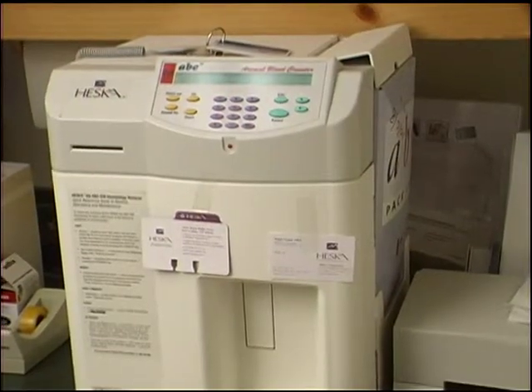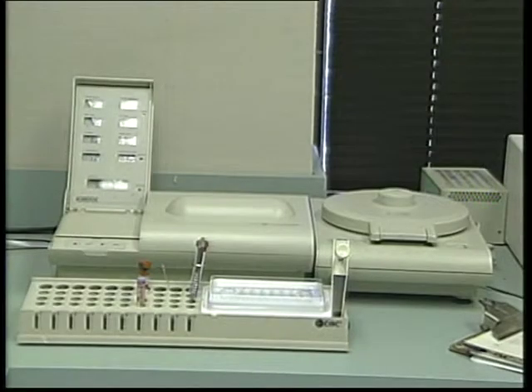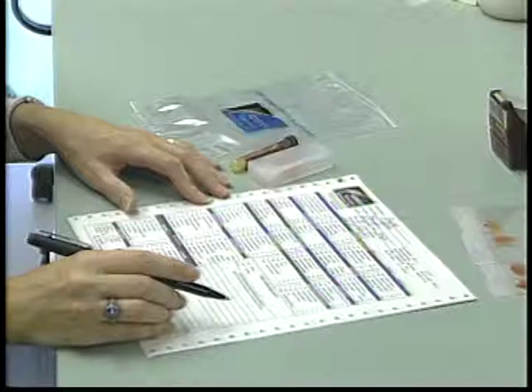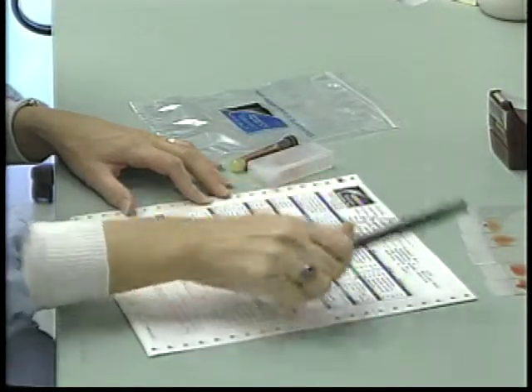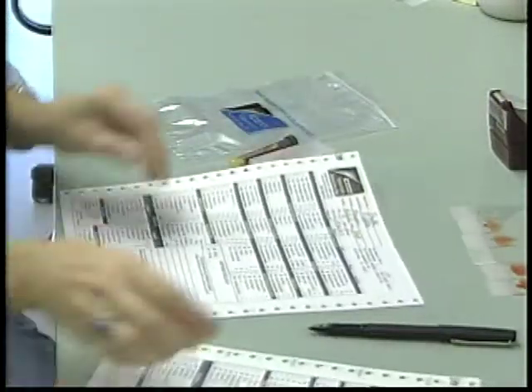Operating these units is relatively easy to learn, and they provide fairly accurate counts or estimations as to the number of blood cells present within the animal. Commercial veterinary laboratories routinely and inexpensively perform CBCs as well.